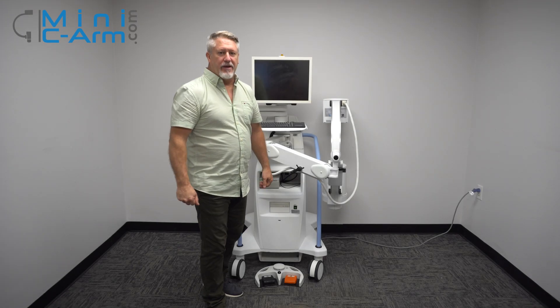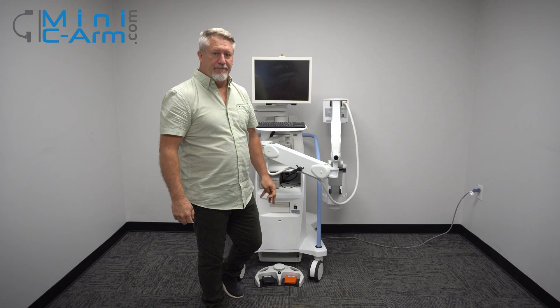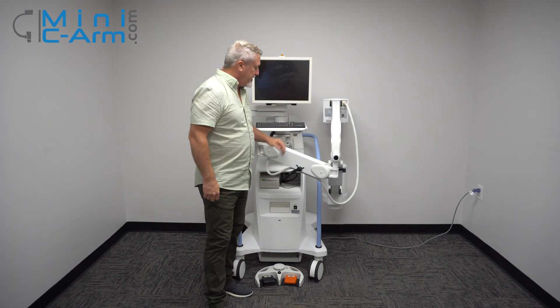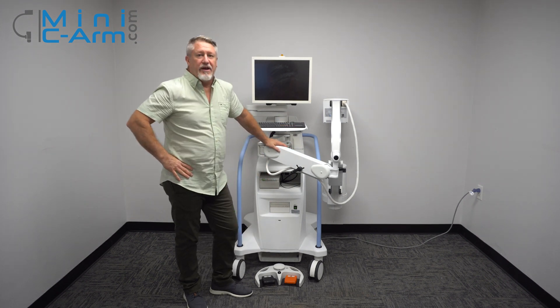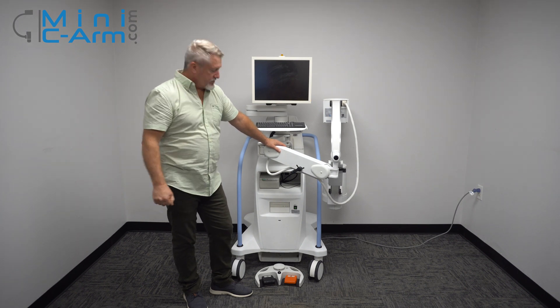Hey guys, I'm Christopher Bacon, the founder of OrthoScan and the president of MiniSearm.com. Today we're going to take a look at the Whole Logic Insight 2 Mini C-arm and just show you basically how it works.